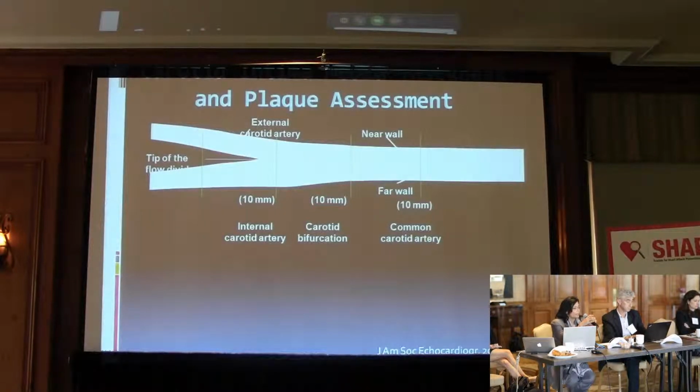So unlike coronary calcium, which is always abnormal, CIMT is a normal structure. We have a carotid artery which has a wall called intima-media thickness, which is what we measure by ultrasound. So that fact alone implies that if you were to use CIMT alone as a marker of atherosclerosis, you will be wrong a substantial number of times because it's a normal structure. Whereas when you identify calcium, because it's an abnormal finding, anything more than 0 implies abnormality.